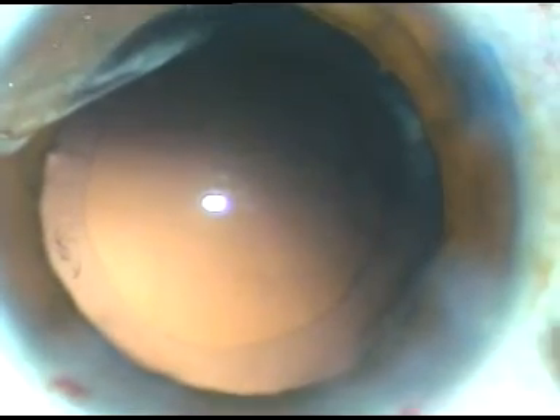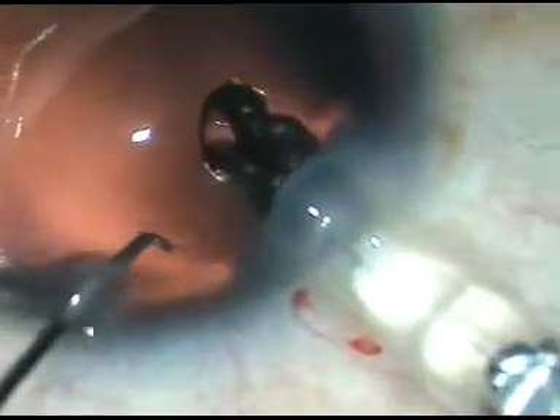This hydro polish technique I got encouraged by Dr. Sri Ganesh. He calls this no-touch polish, meaning you need not touch the posterior capsule to polish it. Just use the jet of fluid to dislodge the cells and fibers and the posterior capsule becomes clear.